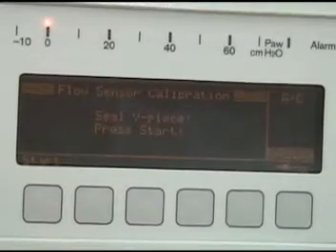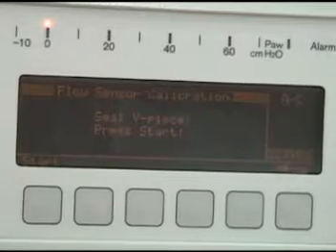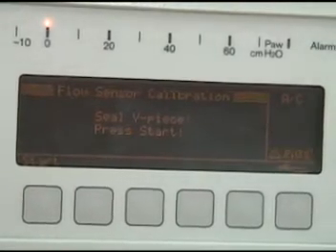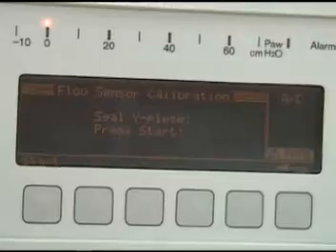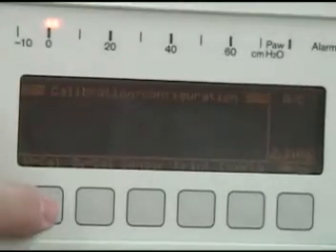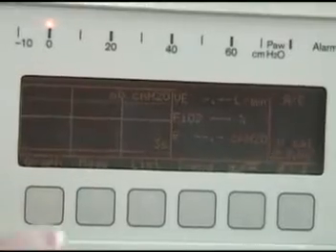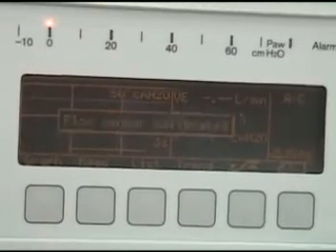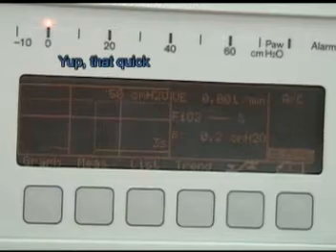Seal the Y piece and then press start. What's that referring to? Yes, we're going to seal this Y piece here. Let's go back there because it timed out, and then we're going to press start — and flow sensor is calibrated.